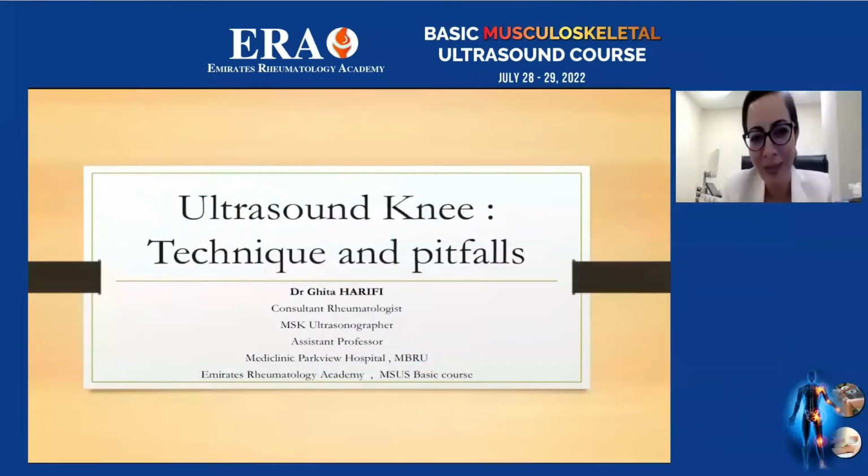Everyone. It's a real pleasure to take part in this musculoskeletal ultrasonography course presented to you by the Emirates Rheumatology Academy. And I'm very pleased to be talking about the ultrasonography of the knee, trying to take you through the actual technique of examination, and I'll try to show you a few pitfalls to be avoided during that journey.